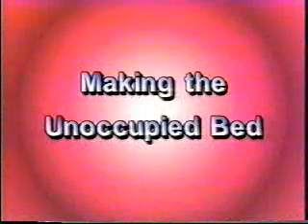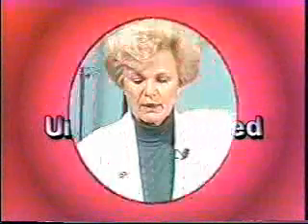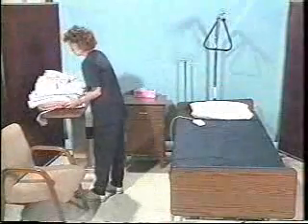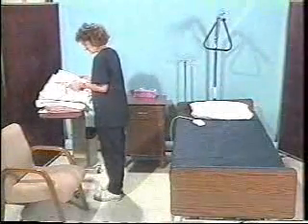Making an unoccupied bed. A patient has been discharged from the facility, and the caregiver is going to make a closed bed after the room and bed have been cleaned. First, the caregiver washes her hands and collects clean linen and places them on a clean surface.